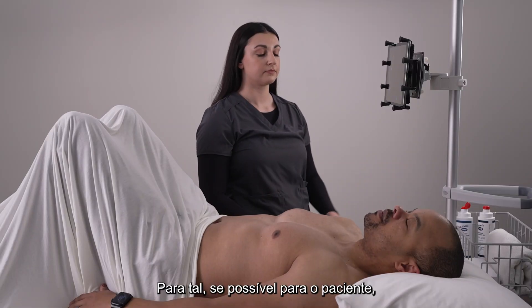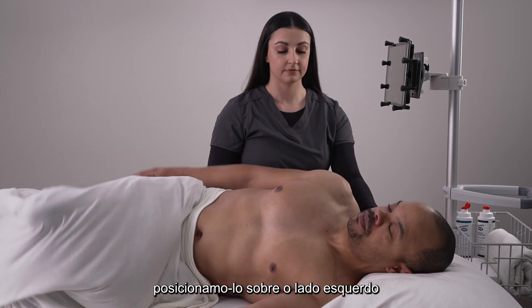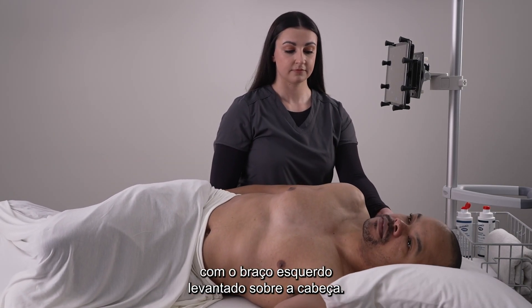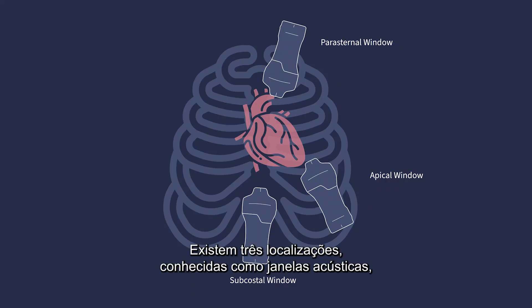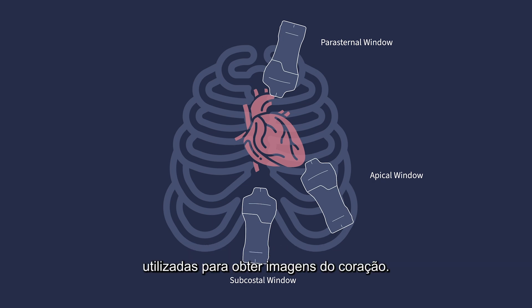To do this, if the patient is able, we position them on their left side with their left arm raised over their head. There are three locations, known as acoustic windows, used to image the heart.